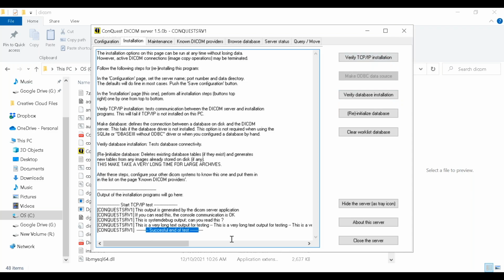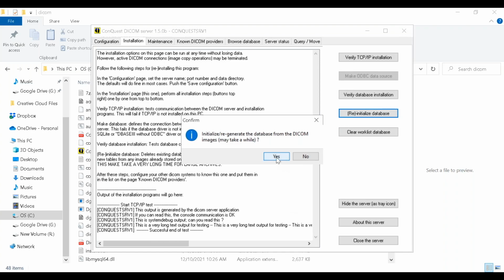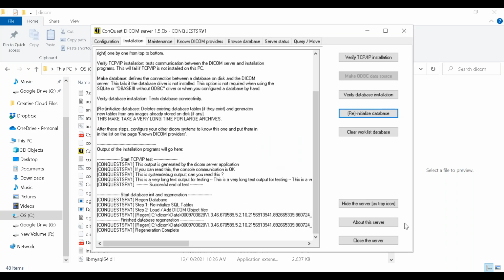And if it says successful test at the end, and can any of you even see this? Okay, well, if you can, fantastic, and you've got great optometrists. Okay, so moving along here. Sometimes that database doesn't like to install. So you might find that you have to reinitialize the database. It'll go ahead and create a log for each one of the sample images. It does have 2 sample images that come with it.